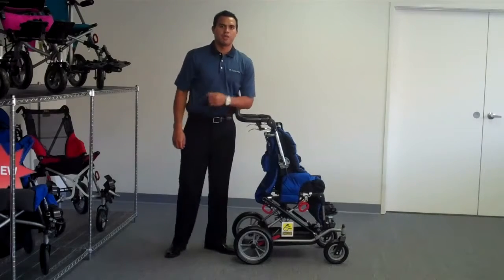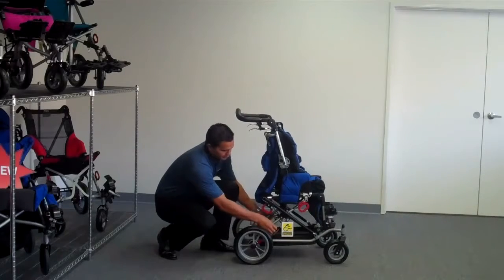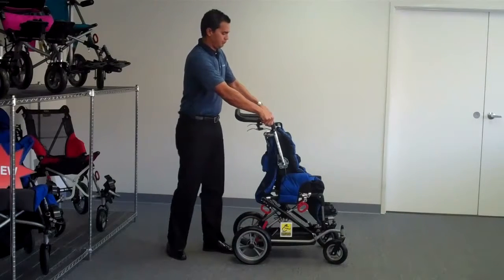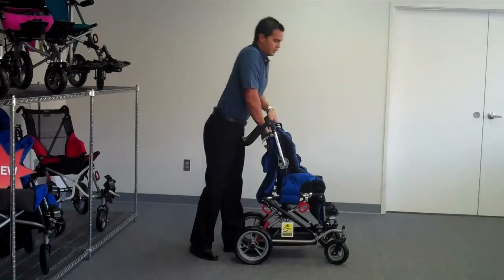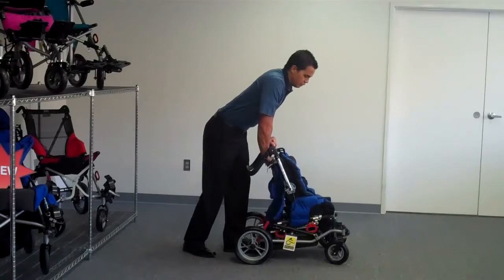Today we're going to demonstrate how to operate the high-low feature of the Cuddle Bug. To operate the feature, simply engage your brakes, lower your push handle by simply pressing on your tray push buttons, and with your weight centered above the chair, pull on your high-low lever and lean forward.